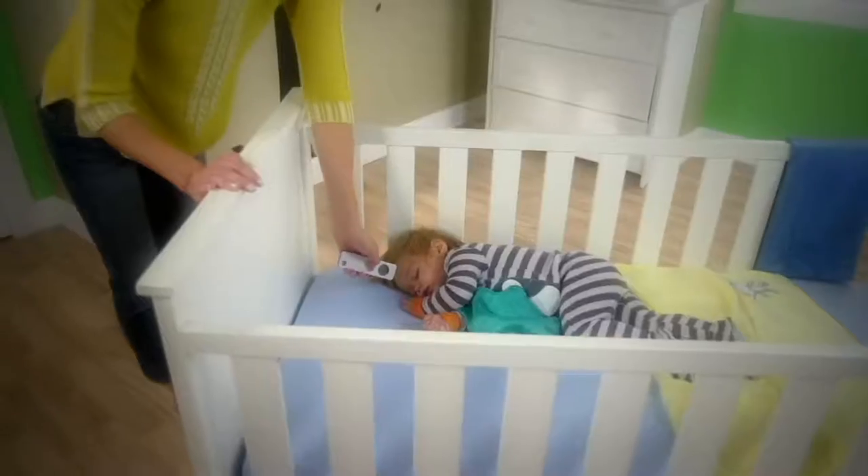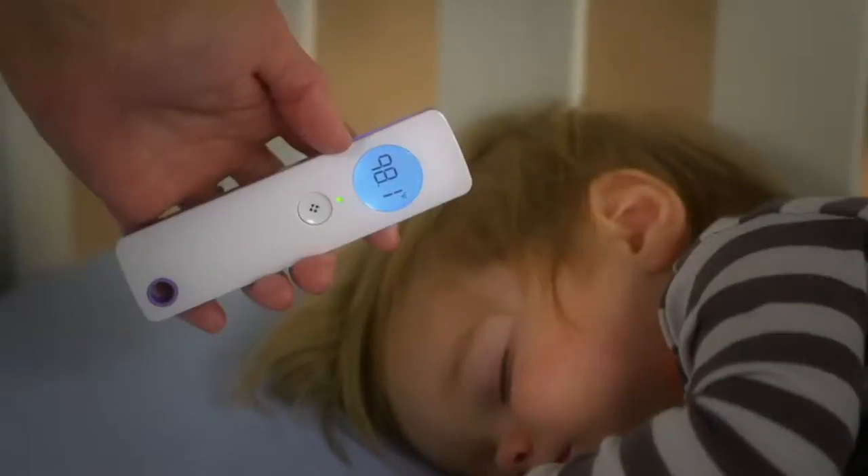You held it a little too long — you just do it quickly. You can actually just see it light up and then you know it's done. Just raise your eyes and look; as soon as it turns, you know immediately. I had hair in front of my forehead. Oh, I changed it to Celsius — which, by the way, you can do Celsius or Fahrenheit.